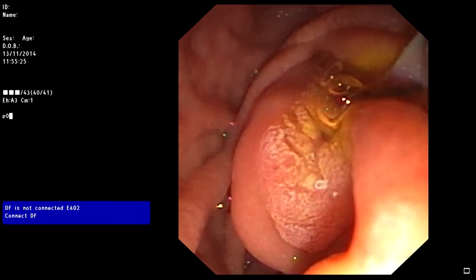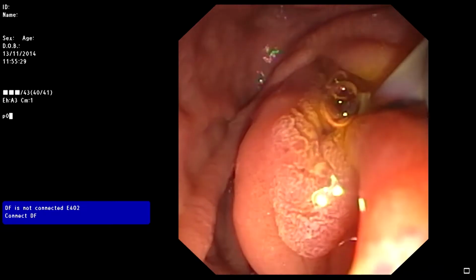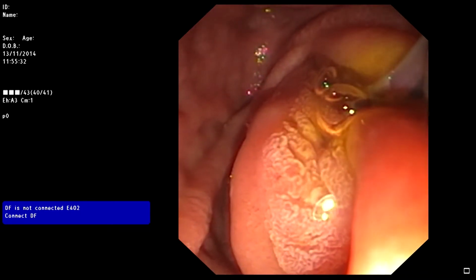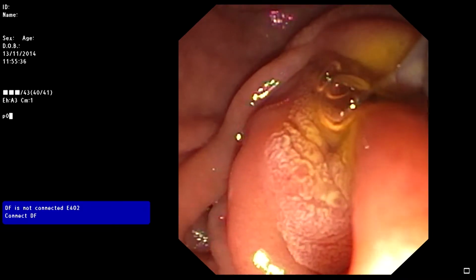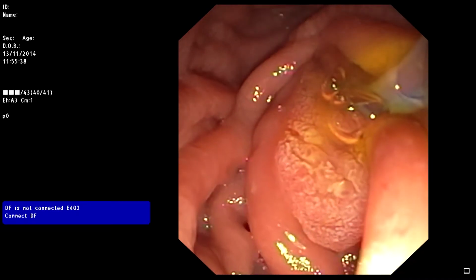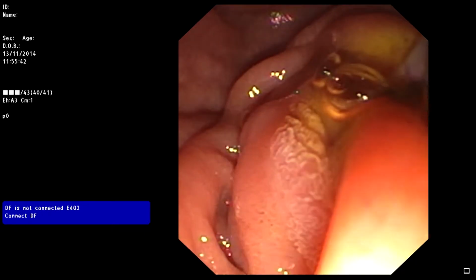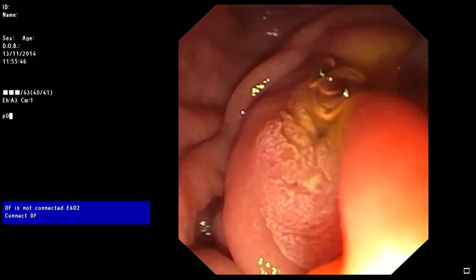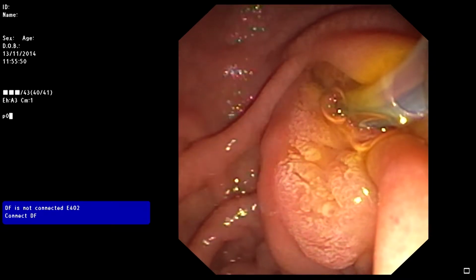So, Alex, are you in the duodenum? Yes. Do you see endoscopy or X-rays? We saw you. Now we see endoscopy, and we hope to see X-rays. I'll try to have all three pictures on screen. Now we are in the duodenum, and I'm giving the floor to Alex. Of this patient, we discussed her situation. What do you do now?